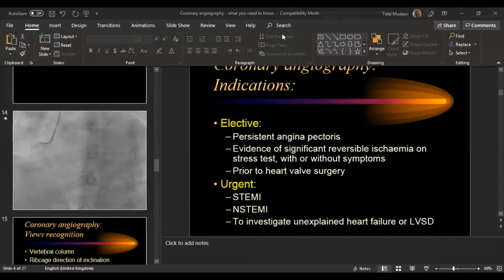النقطه التاليه ذكرتها يا عبد الرحمن، ذكرتها دقيقه اتذكرها يا ربي كان شنو، ايوه السيبريشن بتاع الفيسلز. this is mostly true انه لو فعلا في كودال فيو بيكون دي والسيرك كبير، ولو كان كرينيال بيكون السيبريشن almost بيكونوا overlapping each other. لكن again this is ما على اطلاقها، بتلقى لك حالات مجغمسه، مرات تلقى السبايدر تضرب تفتش الانجل عشان تعمل سيبريشن ما تلقاهم مجغمسات مع بعض، والعكس برضه بيكون صحيح. لكن برضه يعني mostly true very good point ما في كلام.